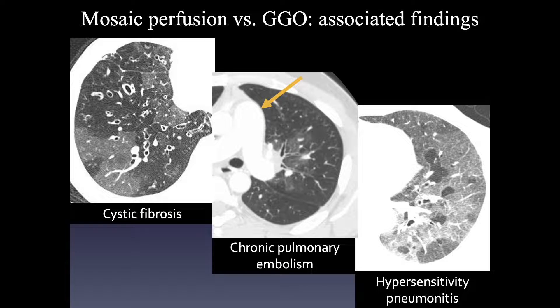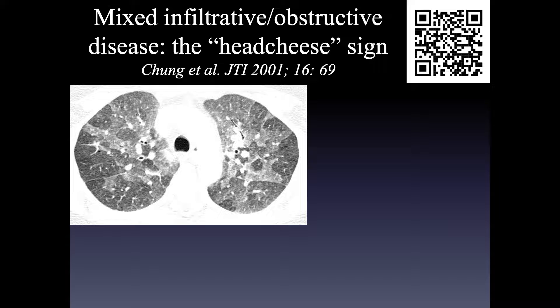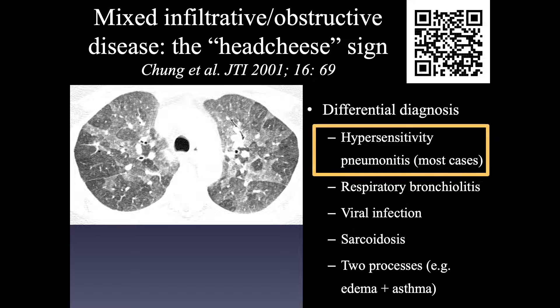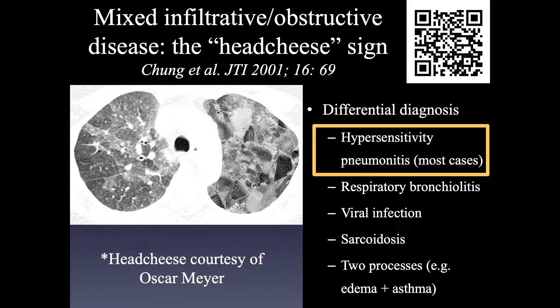This patient actually has both mosaic perfusion and ground glass opacity, as evidenced by three attenuations of lung: two lucent, two opaque, and relatively normal intermediate attenuation lung. This combination of three densities of lung has been described in several ways, but probably the most graphic is the head cheese sign. Head cheese is a meat that's sliced up and has a very similar appearance to the CT shown here. The differential diagnosis includes several entities, but the vast majority of cases are hypersensitivity pneumonitis.